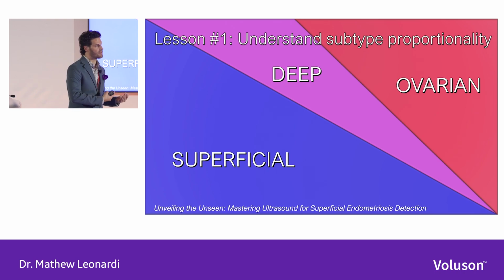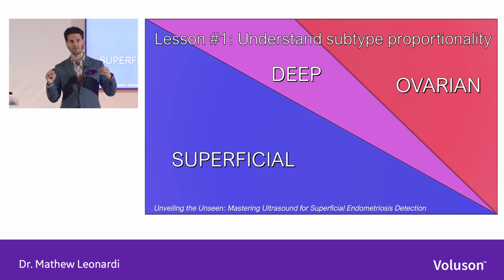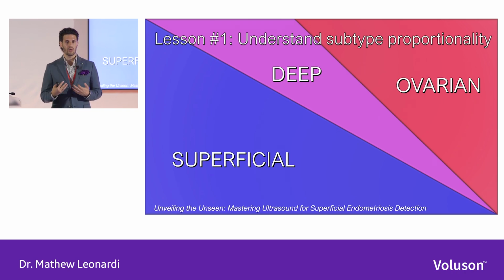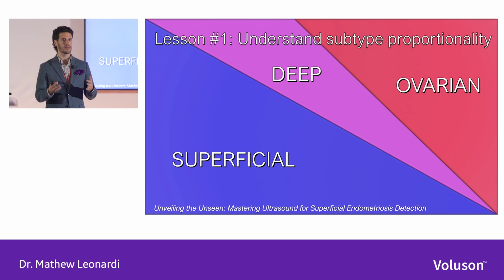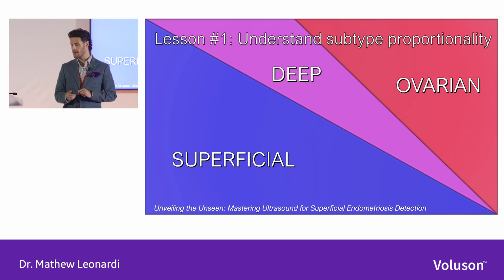But the second half of the screen is superficial endometriosis, which means there's a huge population of individuals who have historically had a normal advanced pelvic ultrasound for endometriosis. And often that comes along with some invalidation. Things are normal, things are looking good. People don't really want to hear that when it's discrepant from how they're feeling. So this is one of the main reasons I've pushed forward in the approach to ultrasound for superficial endometriosis, to pick up this second half of the population.